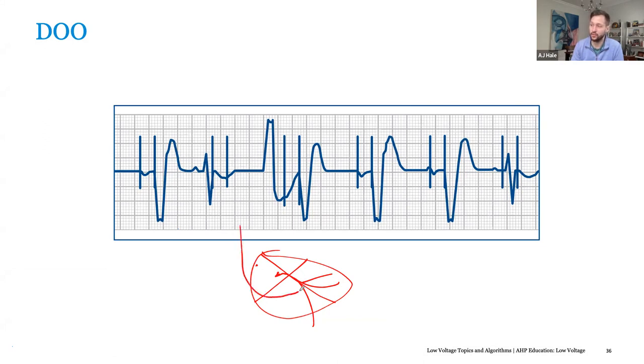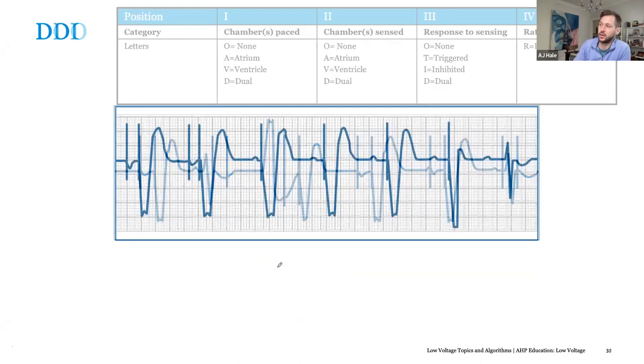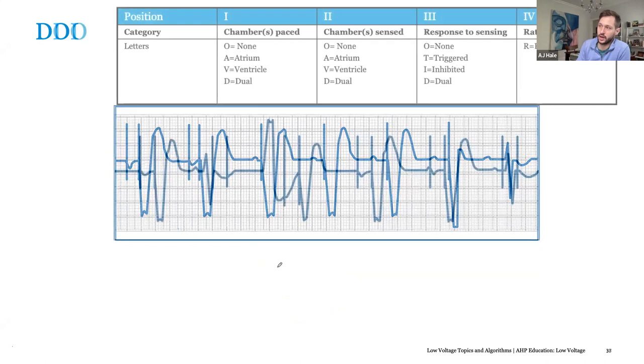So like you said, you put a dual chamber device in, correct? Yes, correct. Okay, so say this is our IVC, SVC, SVC, IVC. We have our dual chamber device. I probably should use different colors here. Based on that EKG, we are accurately sensing what's happening in the ventricle and what's happening in the atrium, and withholding that pacing. We'll hit on this when we talk about our dual chamber modes later.